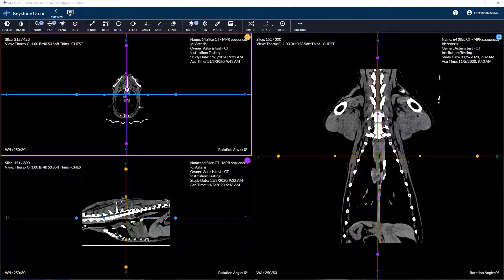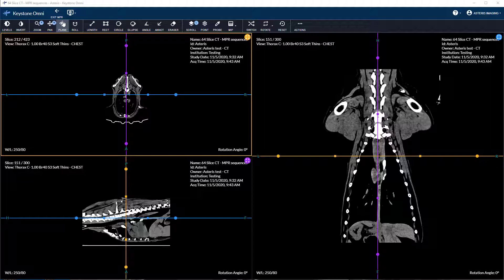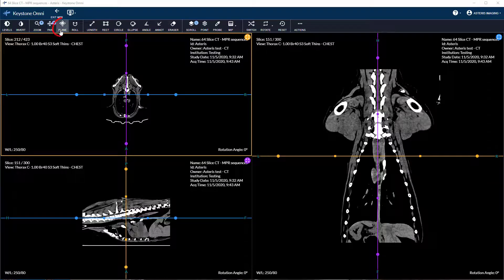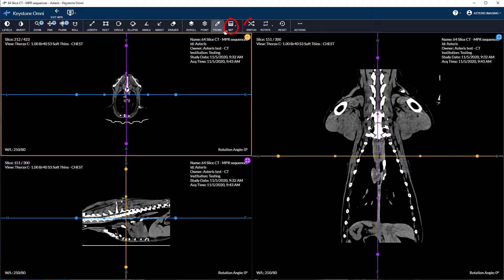The toolbar includes all available tools within the standard canvas with the addition of rotate slice plane, intensity projection, and switch views.